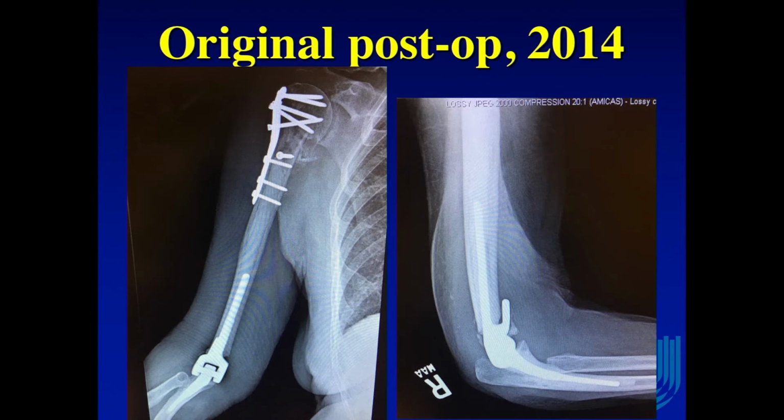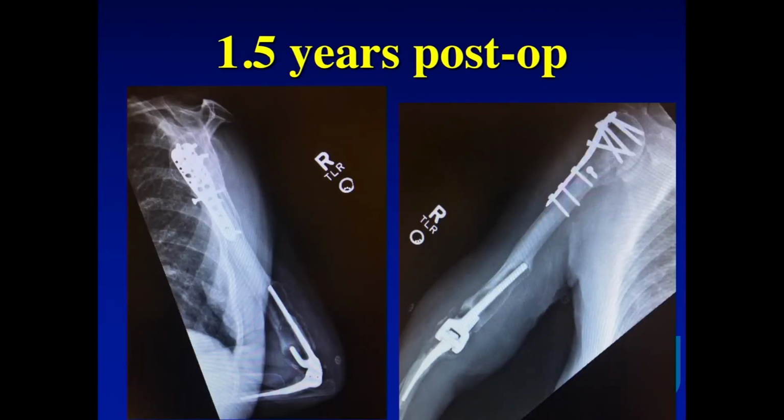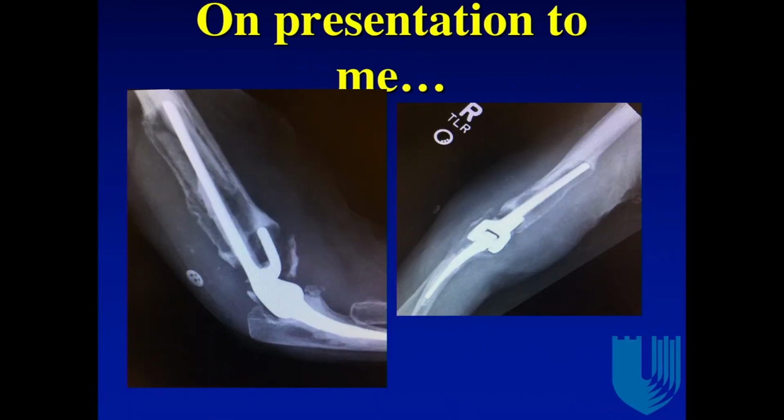So this is a case that illustrates many of the points that I'm alluding to. It's a case of my partner, and I can tell you that this was a very difficult and challenging saga for him. In 2014, you can see the obvious stress riser between the plated proximal humerus and the total elbow arthroplasty distally. You can also see the cement in the proximal humerus right underneath the plate, which could be a significant problem in revision cases. Now, at 1.5 years post-op, you're starting to see some evidence of loosening distally, and here she is now with pain and loosening distally.